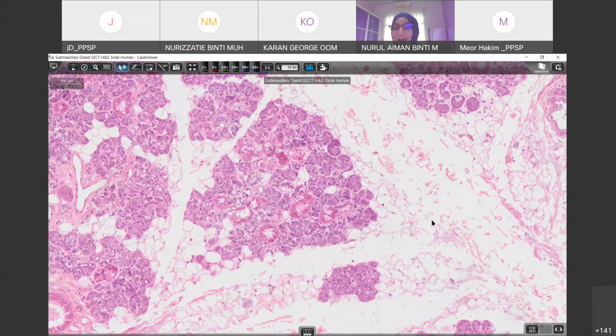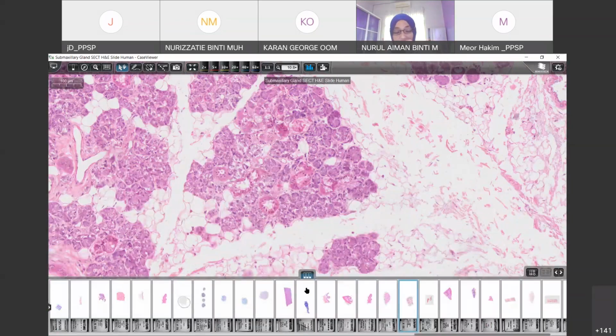This is acina, because this type is compound acina, the lumen is too small. You can't see the lumen. But the one I showed just now, the sublingual gland, has a tubular component. It is a combination of serous acina and tubular gland.